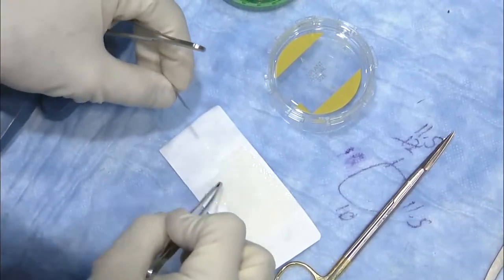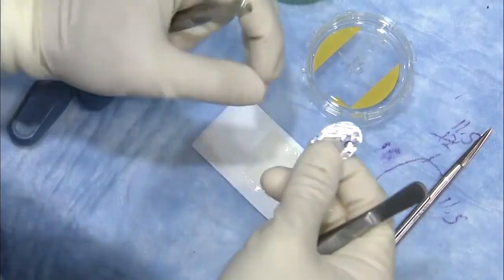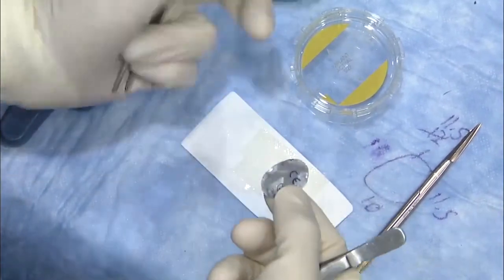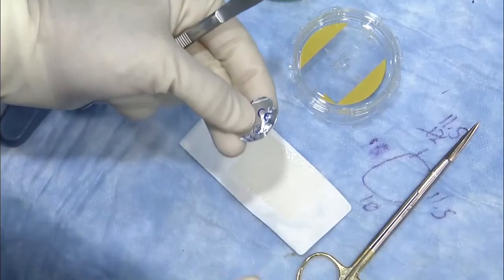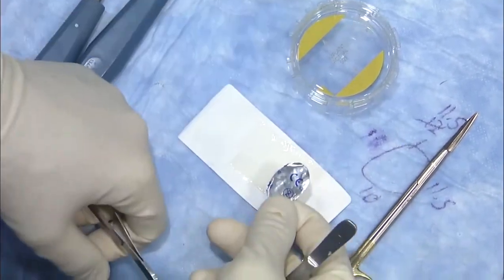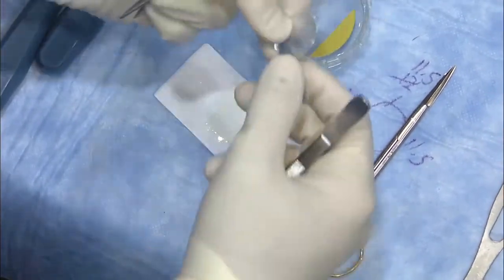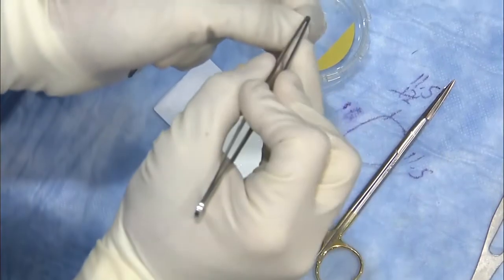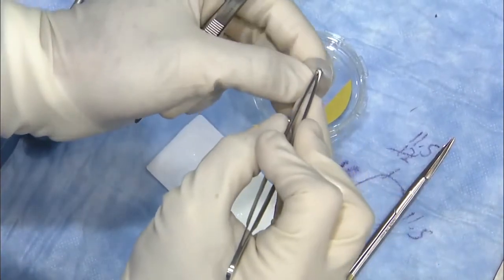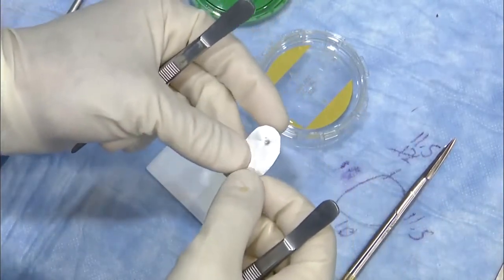So now, if you're going to keep this side up, essentially upside down, then I'll take my template and go upside down. Now this is an oval, so it's symmetric, but if you have a regular geometric shape, then you can just do it like this, and then at the end you'll flip so you keep your orientation. And sometimes I'll put a dot in the top of my foil so I know that that's north. Again, I try to avoid using a marking pen for this.